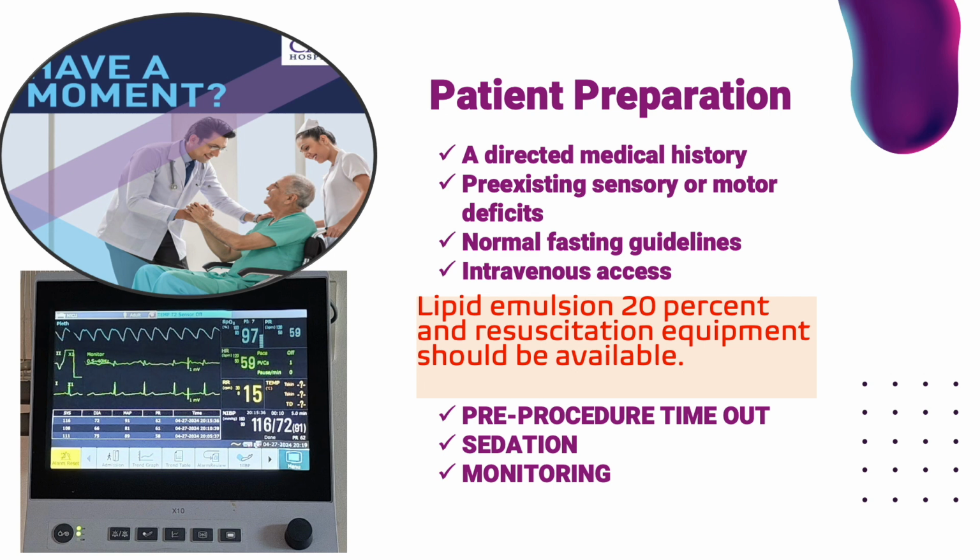It's important to do a pre-procedure timeout, which gives us information about general patient information, the patient's allergies, the side and site to be blocked, and also about the various consents. Checklists have been shown to decrease medical error as well as the incidence of wrong side procedures.